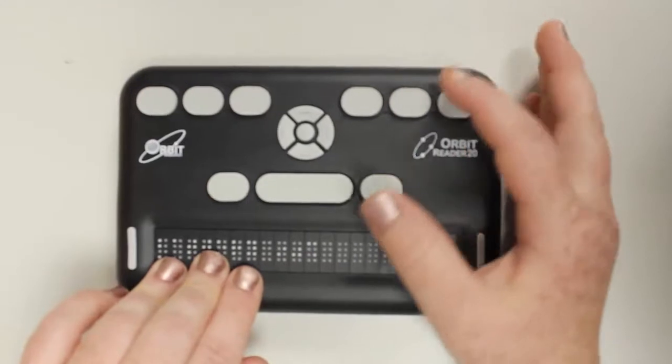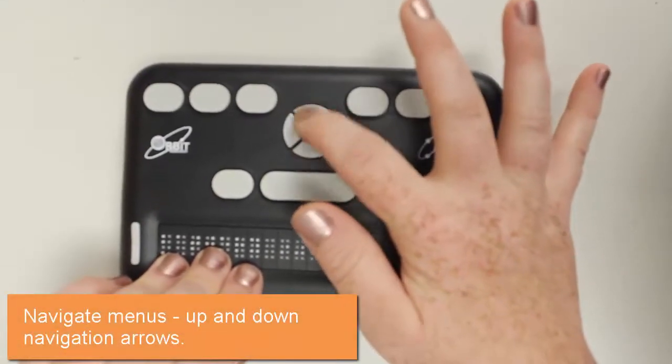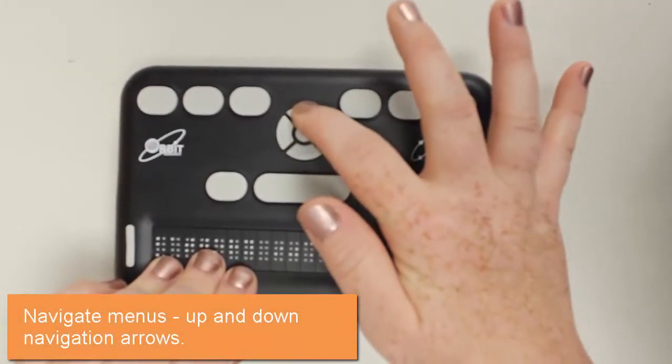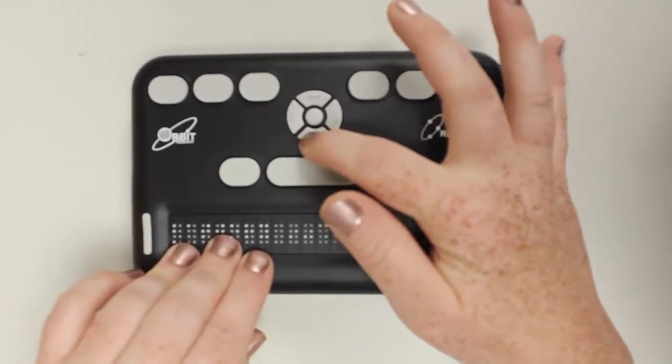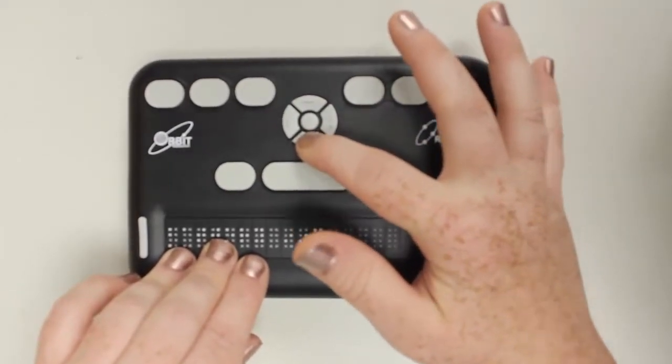To navigate the menus, we're going to use the down and up arrows of the navigation cross. The next menu is the cursor blink rate, and I'm going to show you how to make adjustments.